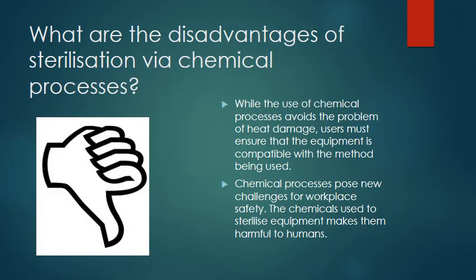So there are disadvantages. While the use of chemical processes avoids the problem of heat damage, users must ensure that the equipment is compatible with the method being used. Chemical processes pose new challenges for workplace safety. The chemicals used to sterilize equipment make them harmful to humans.